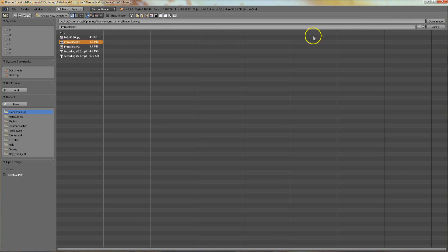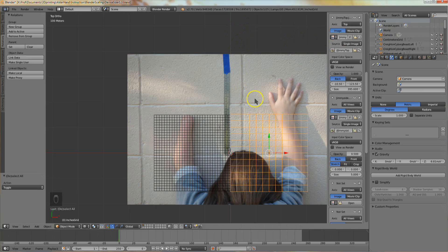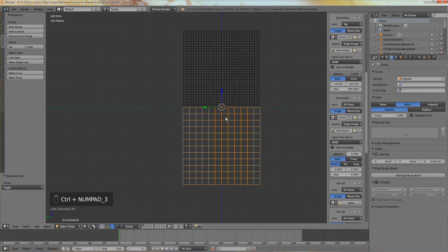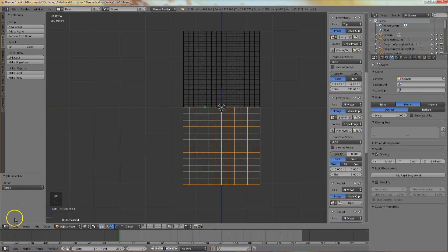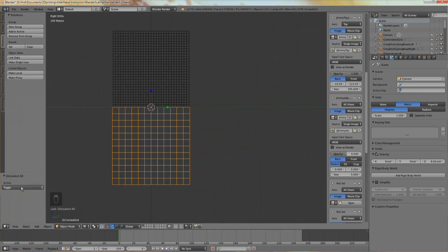The affected limb of this client is a left hand, so I'm viewing it from the right side. Numpad 3 is right side view. If your affected limb is a right hand, your image will be a mirror of this one, so use the left side view, which is control numpad 3. You can also select views here at the bottom left of the 3D window.